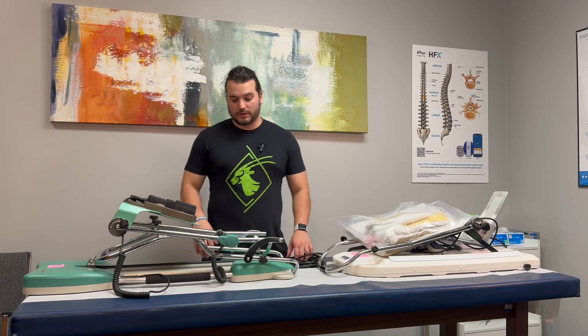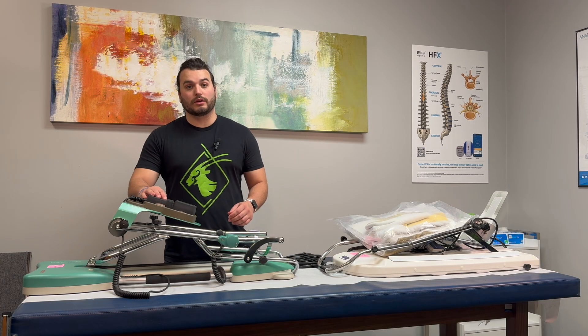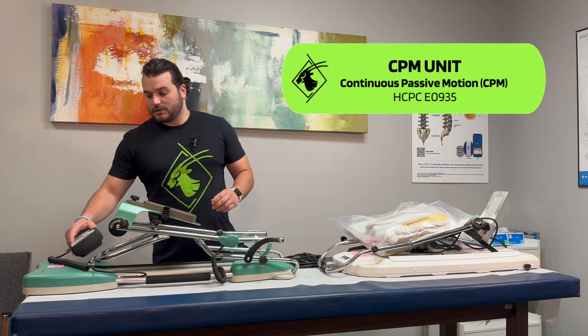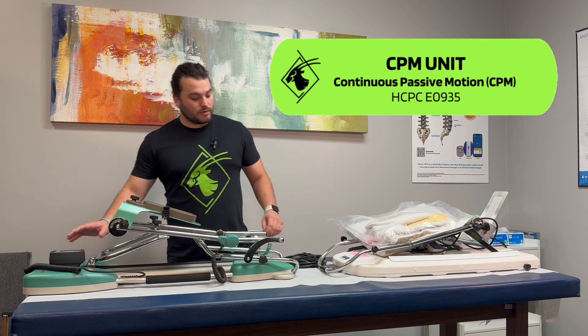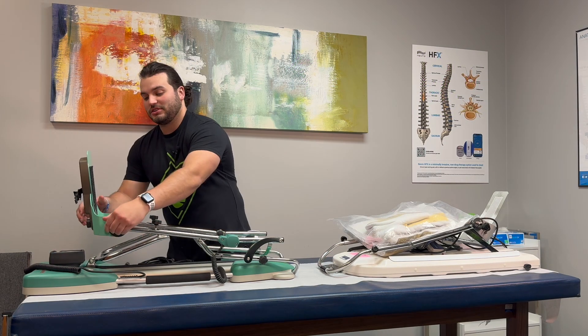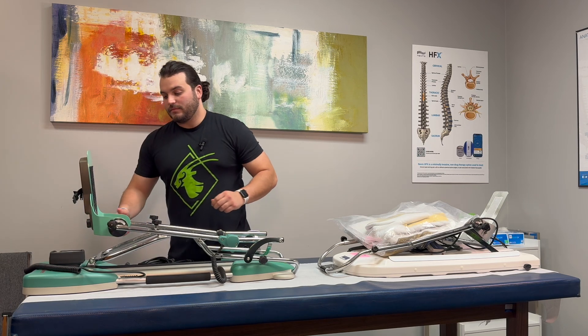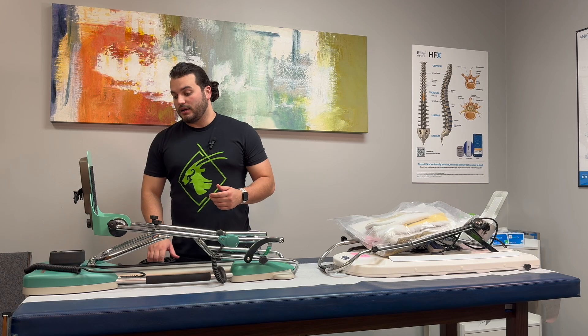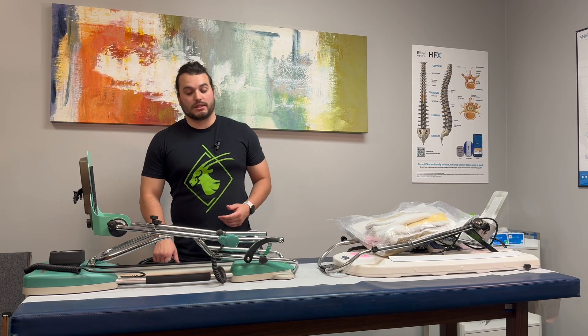Hi guys, Tanner Clark here from Self-Health Care Solutions. Today we're going to go over the CPM machine. The CPM machine stands for Continuous Passive Motion Device. Usually you will get these machines when you are having surgery — usually a total knee, sometimes ACL repairs, and MUA's which is manipulation under anesthesia.